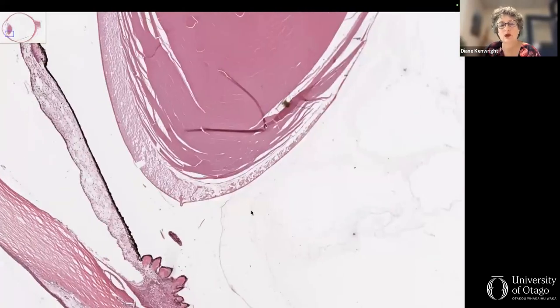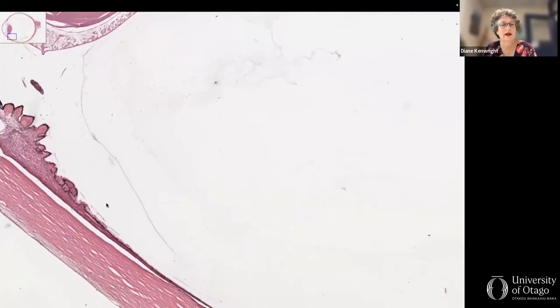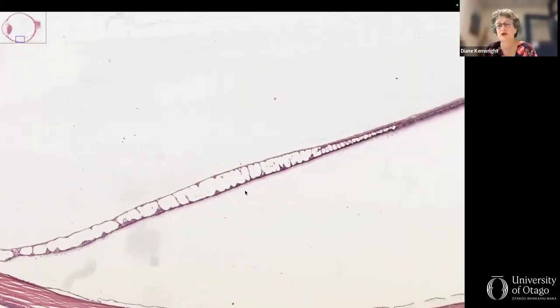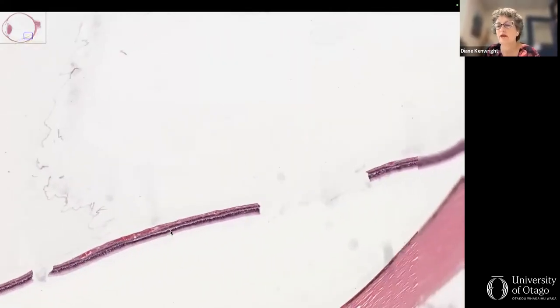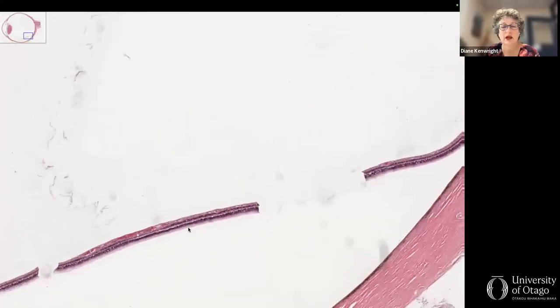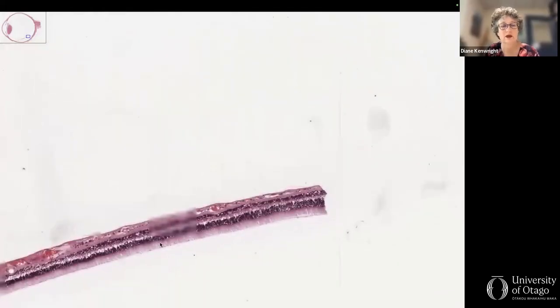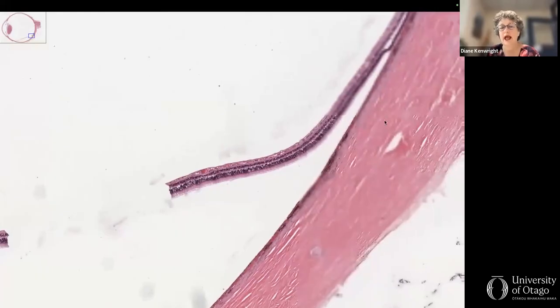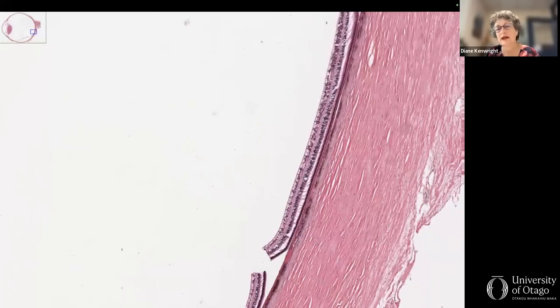So now we go round to the back of the eye. We notice that there's a bit of sclerosis in the ciliary body, and then we go back here. We have the cystic degeneration of the retina. I usually just scan through here because there really aren't that many changes. Let's have a look and see if there are lots of ganglion cells, and the answer is not really here. So we've got outer nuclear, inner nuclear, ganglion cell layer, so that's all looking okay. What that means is that the glaucoma has not persisted enough to give rise to ganglion cell layer loss.